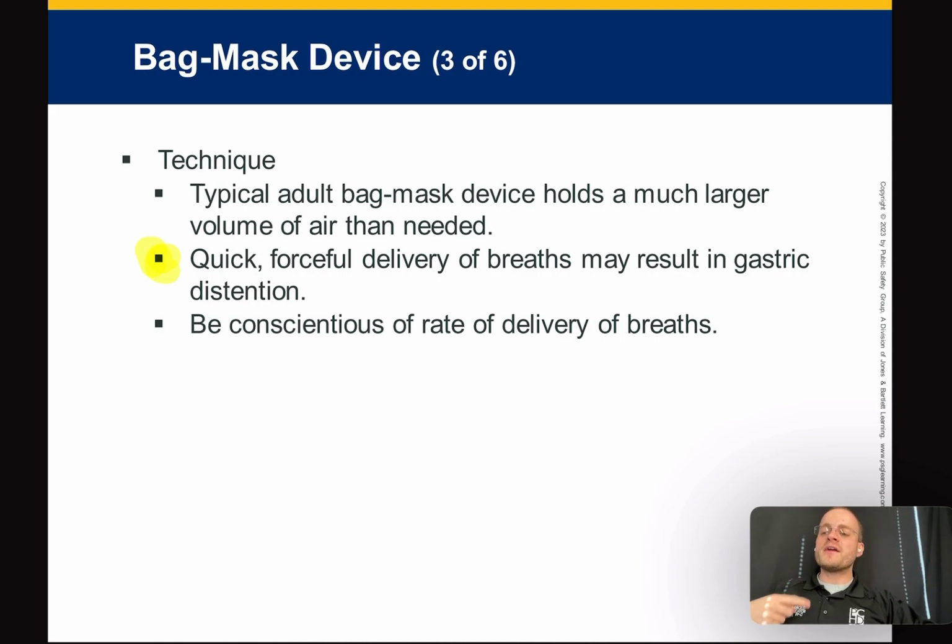So you have to be very conscientious. Even me, right? A fairly experienced provider. I have to be very mindful when I'm using this tool and say 1, 2, 3, 4, 5, breathe. Chest rise and fall. Good. 1, 2, right? And now I might do this internally, but I'm actually thinking this, okay? And if I hand this to a less skilled provider, maybe like a state trooper or someone like that, it might be like, I want you to count to 5 and squeeze it this much. Okay, right? And so that's a way that you can work through that as well, by the way.